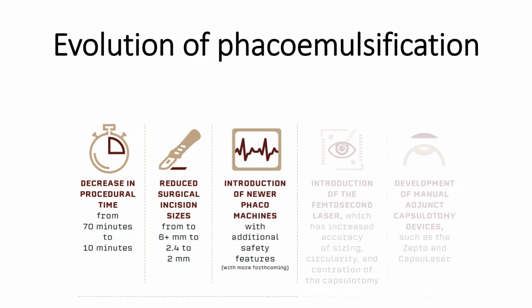With the advent of technology coming into the manufacturing of the phaco machines, we have features which have enhanced the safety and functionality of the machines, and we expect that more of these features will be added with time.